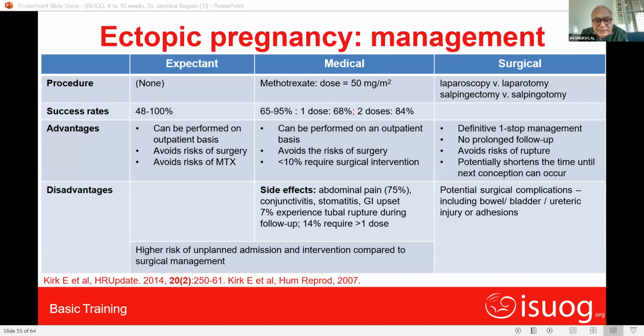You were on the ring of fire, the blob sign, and just after the blob sign you were going to show us how to differentiate the ovarian structure from an ectopic structure. Okay, sir. My slides are not moving yet. It was slide number 51. Okay, one minute. Let me share once again.